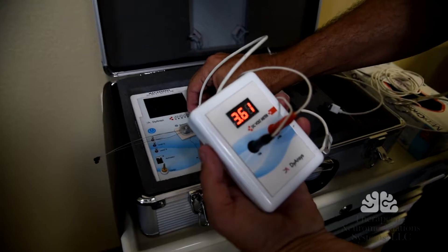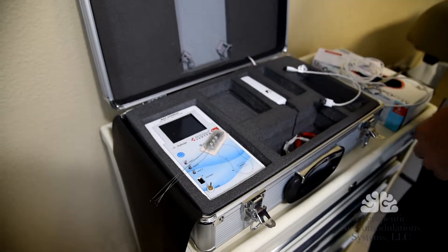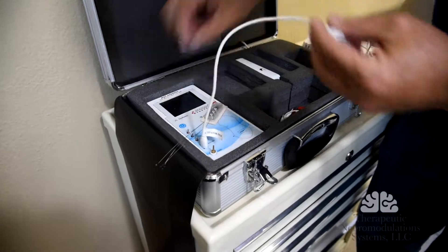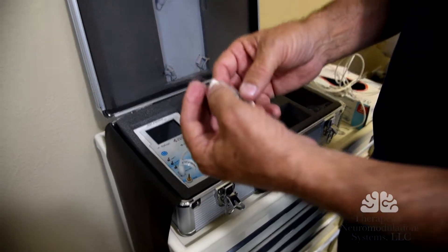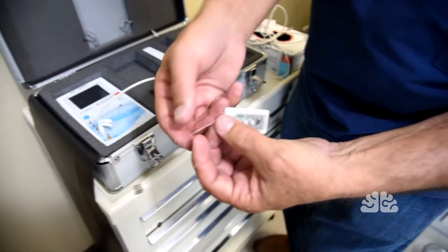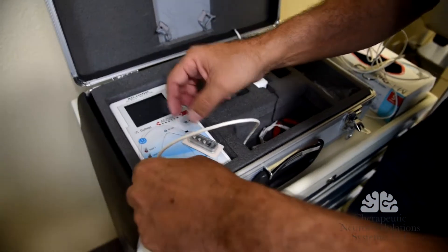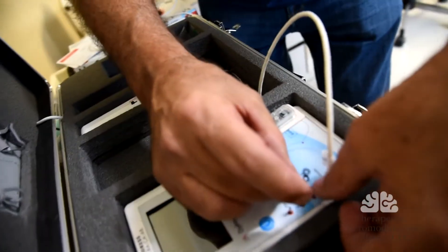So now we're going to go into the programming side of it. Before I put it on the program, I want to show you the device. The single line is the ground, and the other three are the lines that are going to go into one, two, and three. So we're going to place the ground on the device and we're going to place the other three leads on one, two, and three.